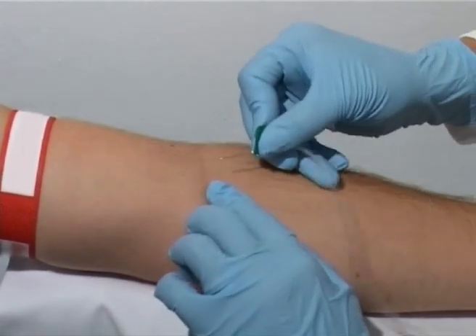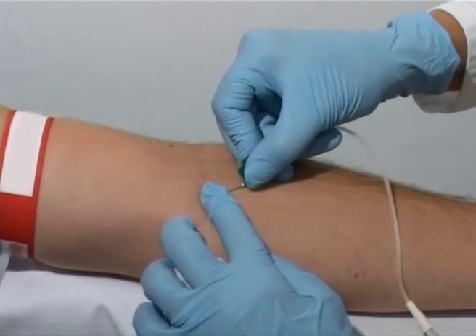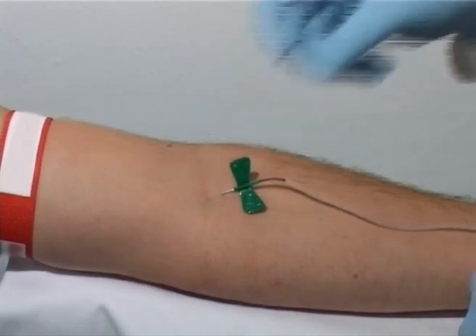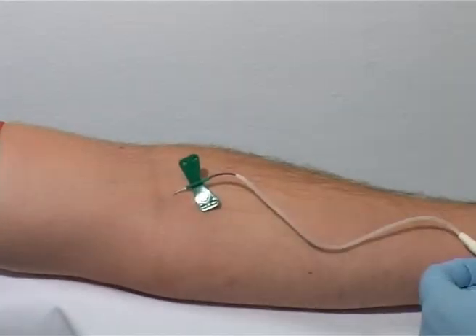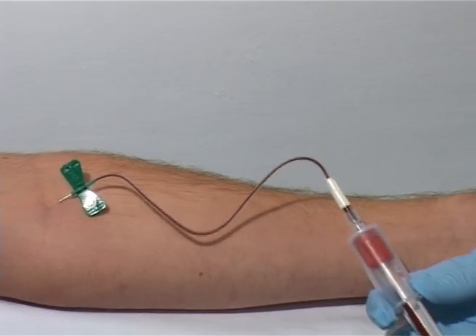To perform this test, you need a timer, which can be set to at least half an hour, three single-use 1 mL syringes, several 0.8 mm needles to load the syringes, and three 0.4 mm hypodermic needles for injection into the skin.